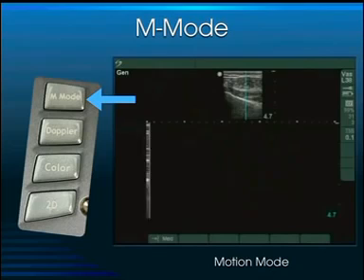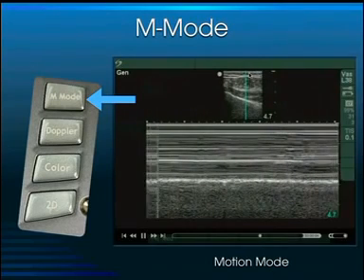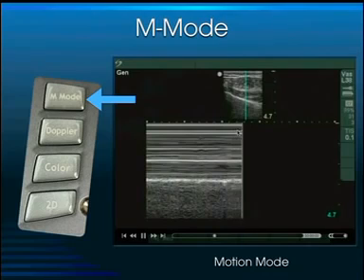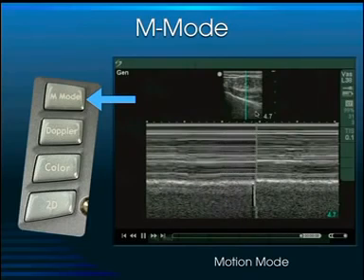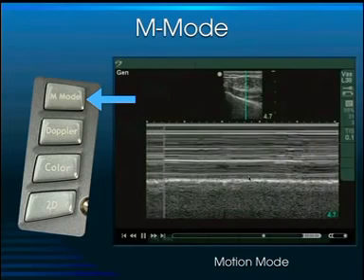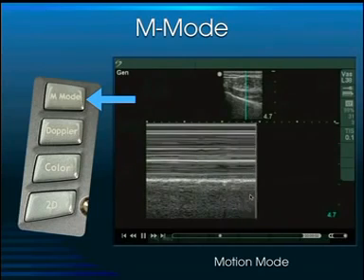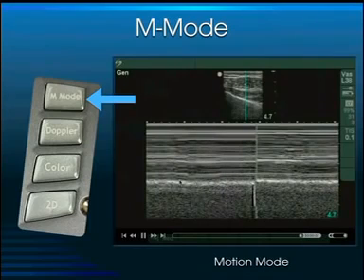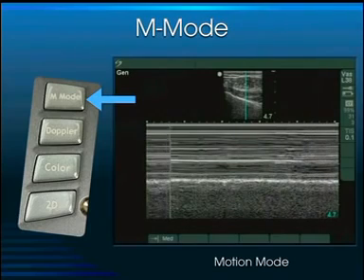The next button you may encounter is the M mode. The M mode stands for motion mode, and the part of the spike that corresponds to the top of the tissue corresponds to this graphical representation right here of motion. This is a two-dimensional tracing of anything moving on the screen. So structures down here, like this is the pleural line right here, because that's sliding back and forth, we see it represented as sandy appearance down here at the bottom of the screen. So motion appears granular, whereas structures that are static over time appear as horizontal lines when using motion mode.